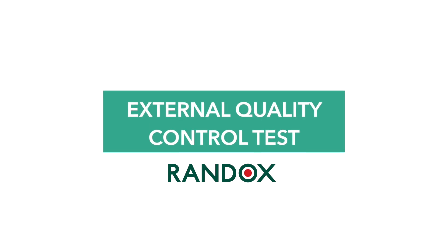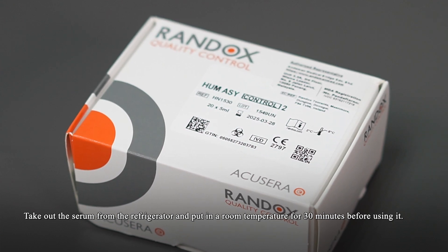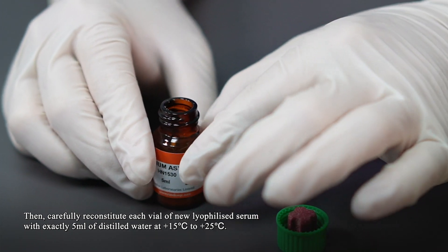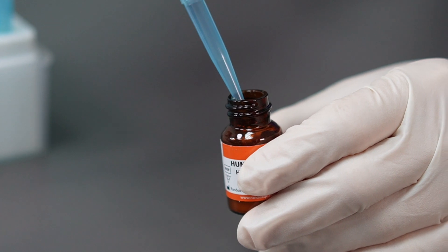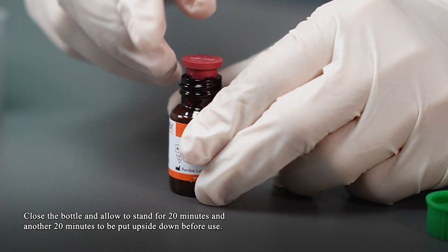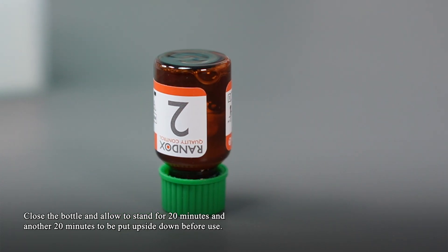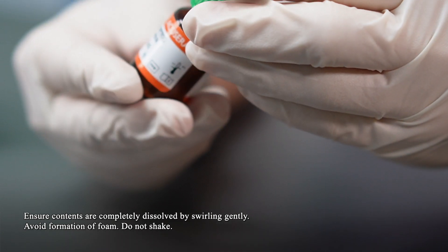External quality control test: Take the serum out of the refrigerator and leave it at room temperature for 30 minutes before use. Then carefully reconstitute each vial of serum with exactly 5 ml of distilled water at 15 to 25 degrees Celsius. Close the bottle and allow it to stand for 20 minutes, then another 20 minutes upside down before use. Ensure contents are completely dissolved by swirling gently. Avoid foam formation. Do not shake.